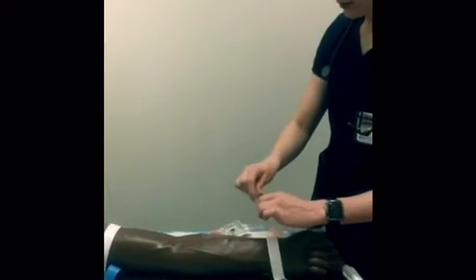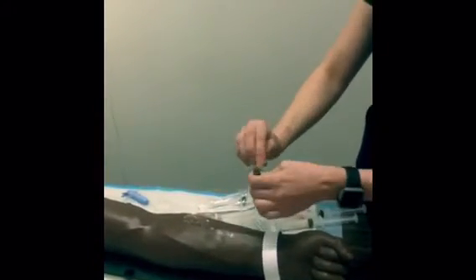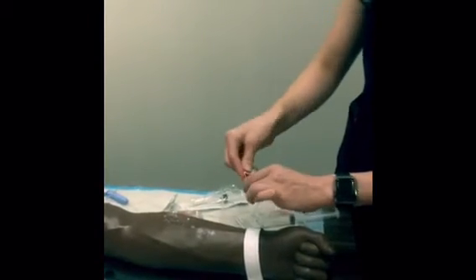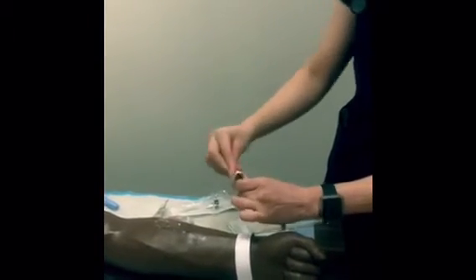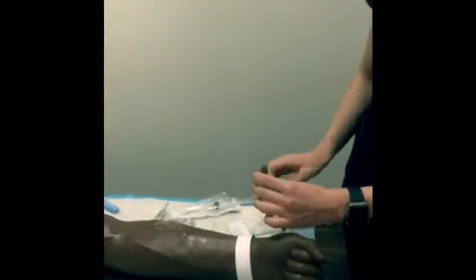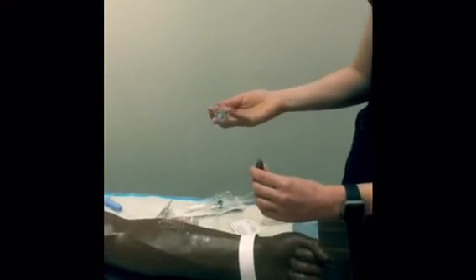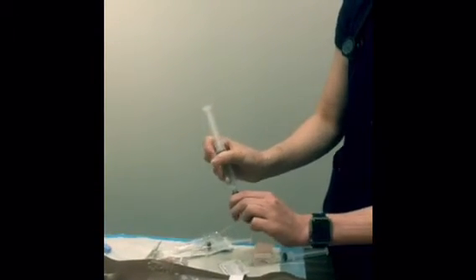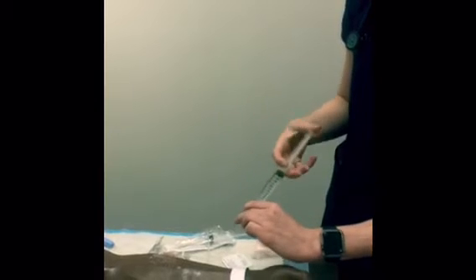We're gonna open this. I've got an alcohol swab to clean it off. I'm gonna scrub for 30 seconds, make sure we get that good and clean, and then let it dry because we don't want any stinging when that happens. So first, before we put the medication in, I've got a flush. I'm just gonna hook that up. Flush that in, make sure there's no infiltration, it's going where it's supposed to go. Alright, we're good.